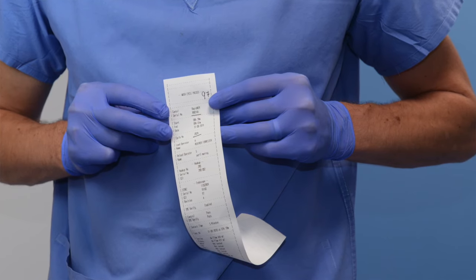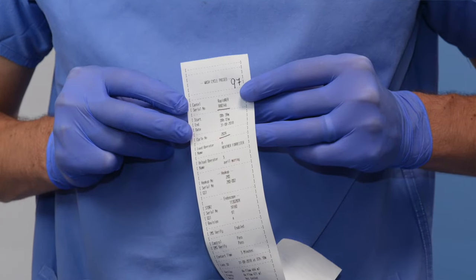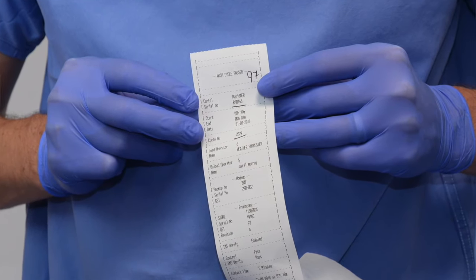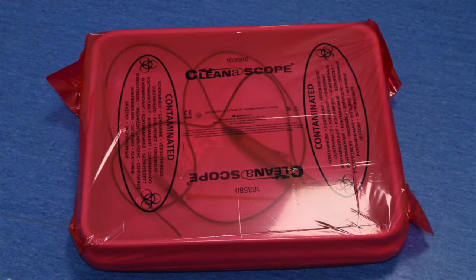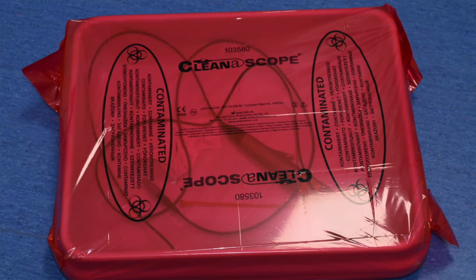When packaging the fiber optic scope back in its box, put patient information along with the date and time the scope was used. On this piece of paper you'll find a cycle number and serial number which should also be documented. The red cover then goes on the box. The box is delivered to the endoscopy used goods for further decontamination.